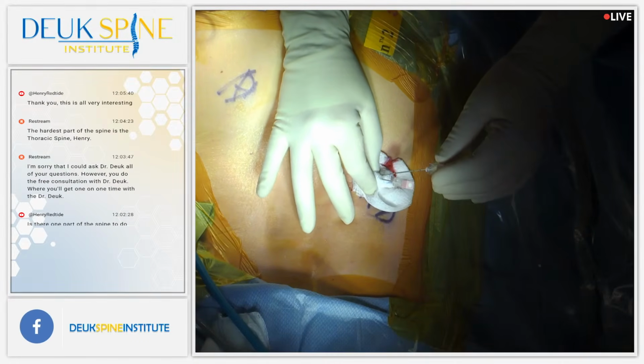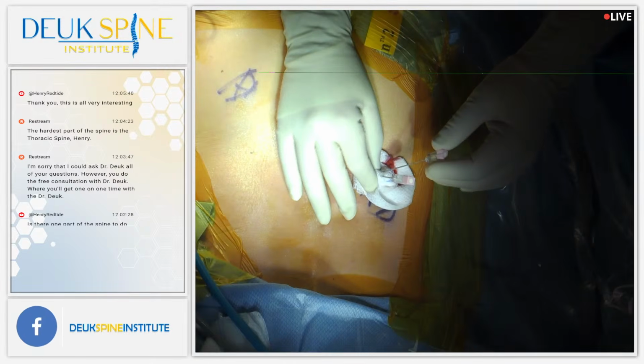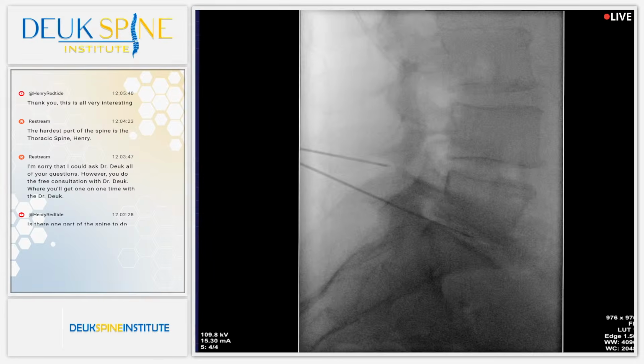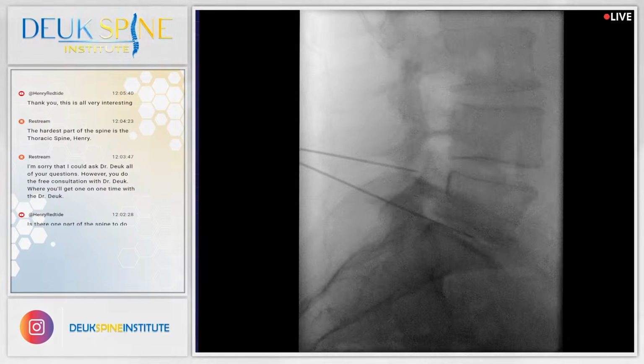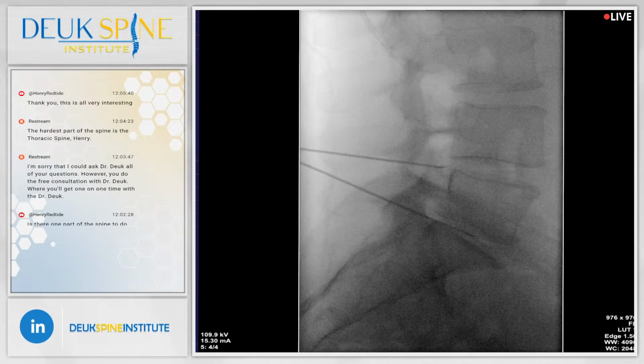It works by first starting out placing what are called spinal needles. I'm placing these needles exactly where I want them in the tear in the back of the disc at L4-5 and L5-S1. Okay? You can actually see the herniation right there on the x-ray. Show them the herniation. Right there. You guys see that herniation?